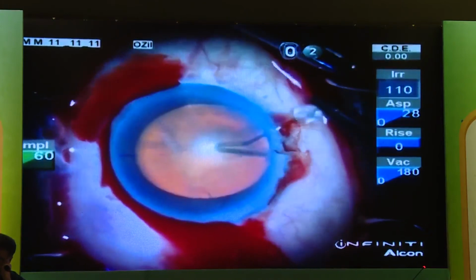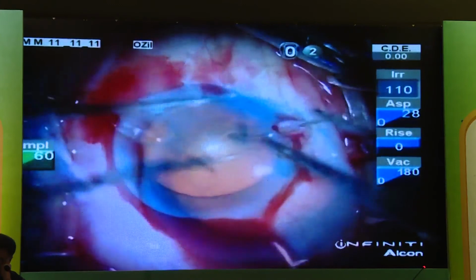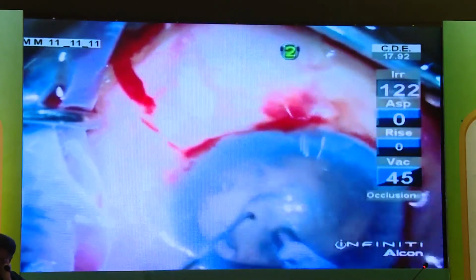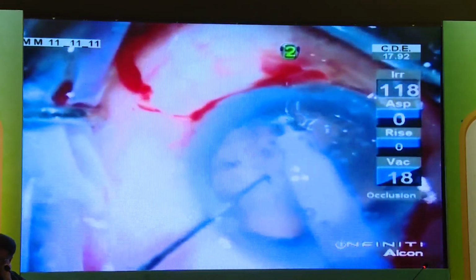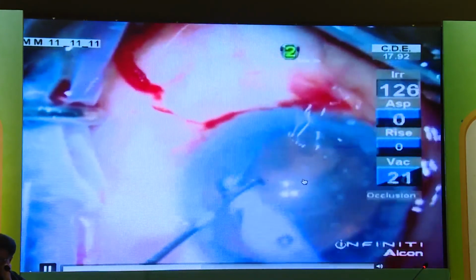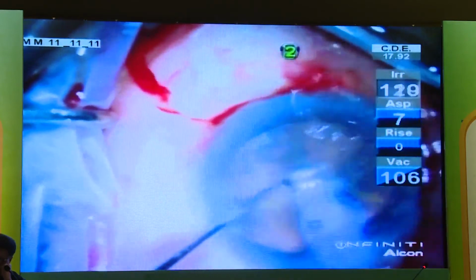zonular loss there. So this one going in supports the periphery. That is good actually. And you are not actually trying to pull it up. You are supposed to just have the tip at the equator. See now, this kind of a sheet of cortex is not at all coming. You have to be very patient and very slow. You know, keep on tugging like this.